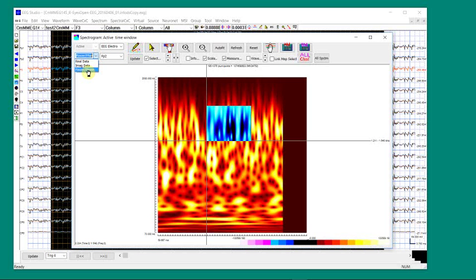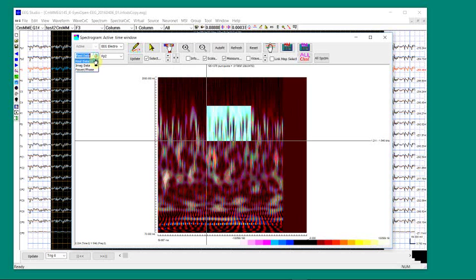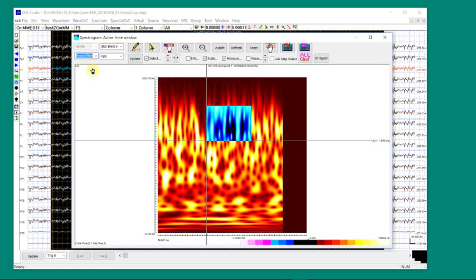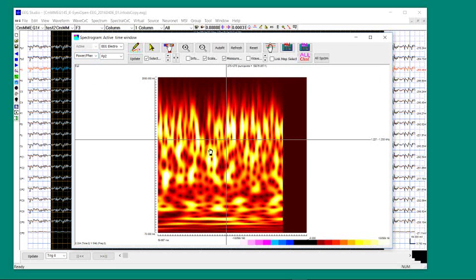That's typically what we need. We also consider real data and imaginary data. Because they have polarity, we can use the real and imaginary power to compute the sources. The power data, as you can see, is always red. That means it doesn't have any polarity information. So that's why we compute real and imaginary.